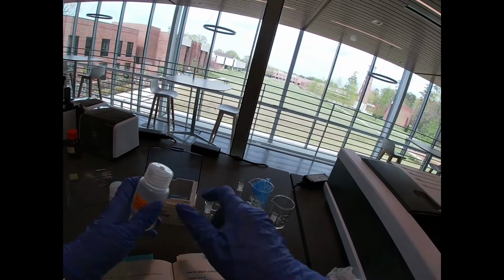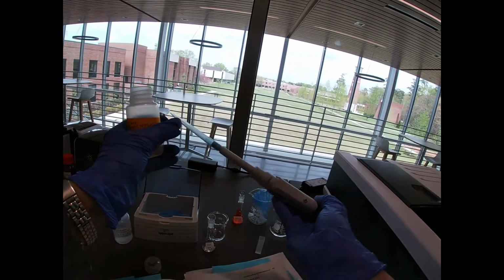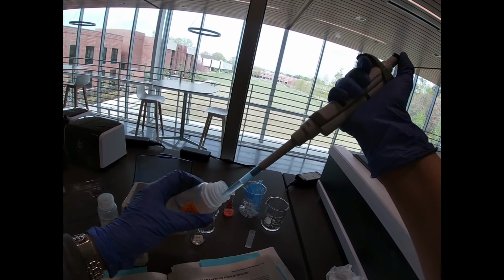And I need to combine that with a milliliter of the iron nitrate solution so that we form our colored complex. Must be getting a bubble.